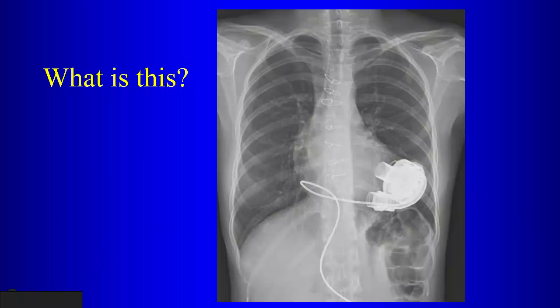These were used for what? Why did patients get these? Bridge to transplant. To bridge to cardiac transplant, right. So the idea is to keep the patient alive with this left ventricular assist device long enough until they would get a cardiac transplant.